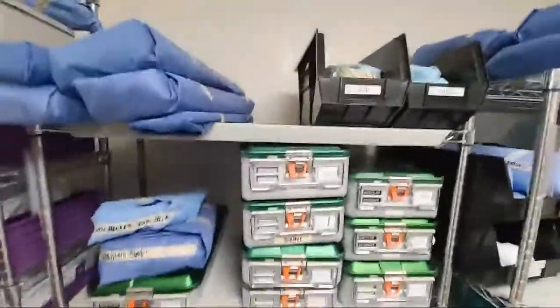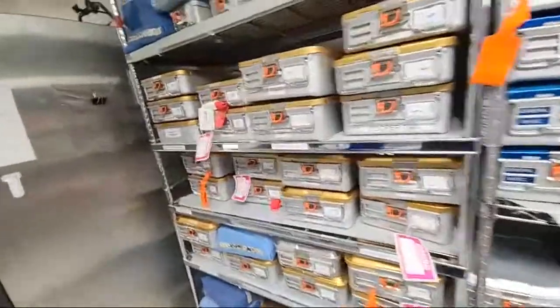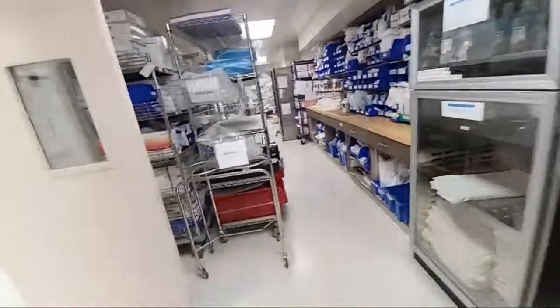And here is a bunch of stuff. Here are HD cams, and here's special doctor trays. So this is where we put everything. Most of everything goes here. There's ortho stuff. Ortho for bone. And we have major and basic trays, which are included in many surgeries. These are ENT trays, ear, nose, throat. We have some plastics trays there. Certain scopes. Scopes. Lots of extra stuff.